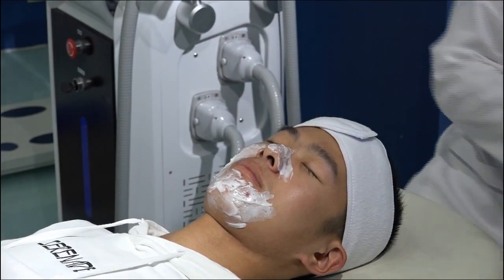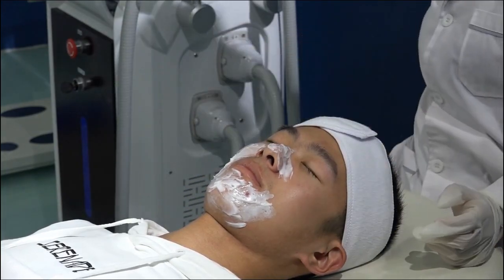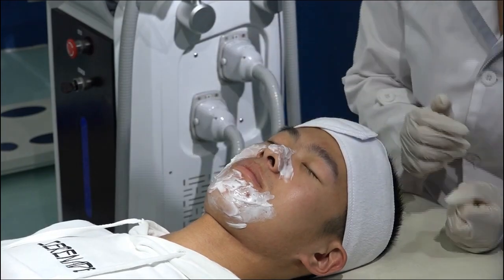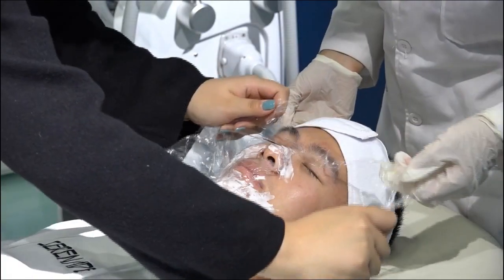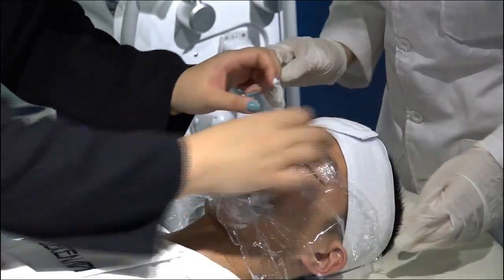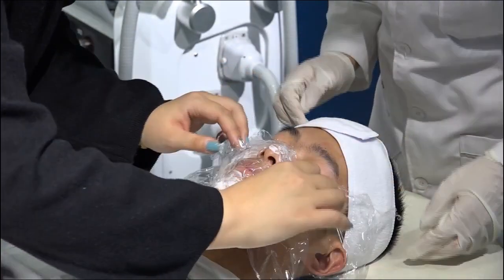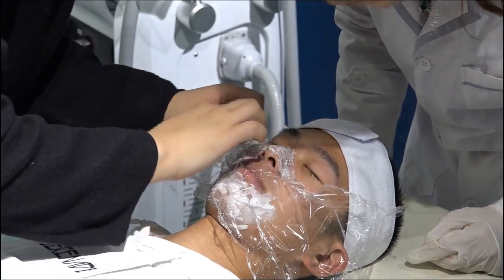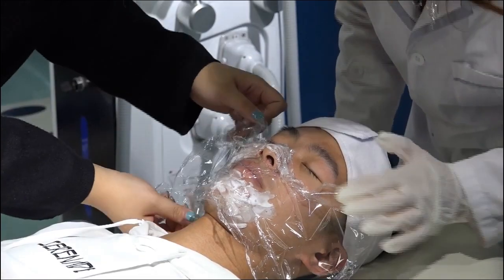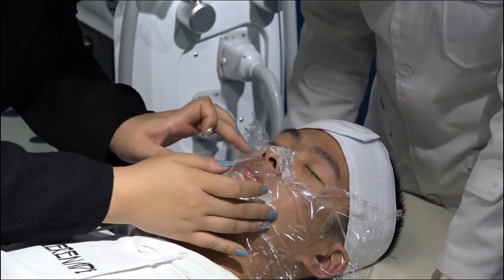Okay, after this, we can use the plastic wrap to cover the treatment area.